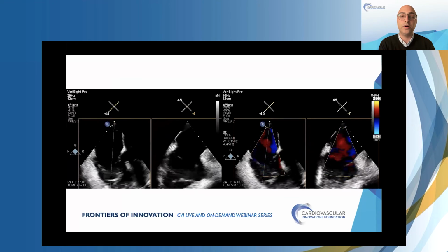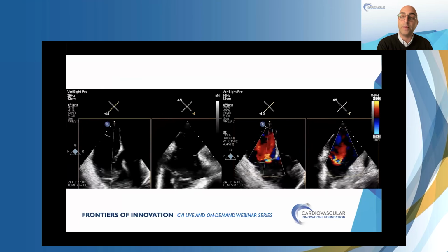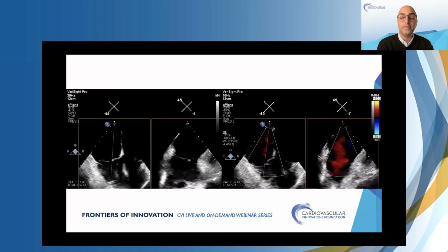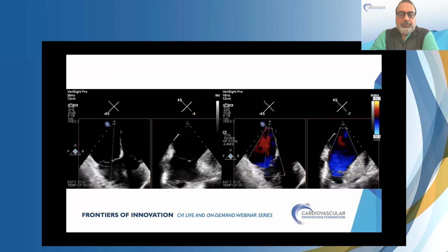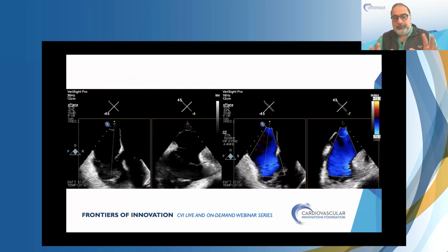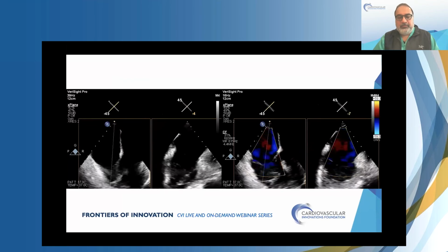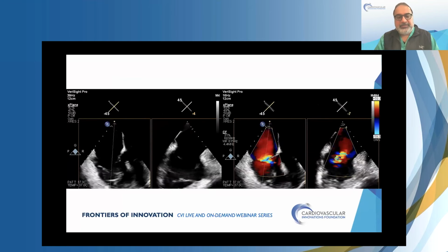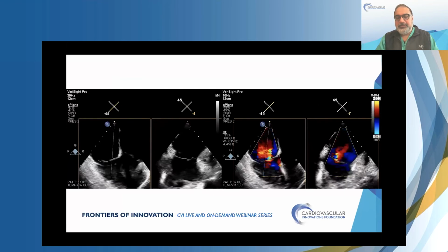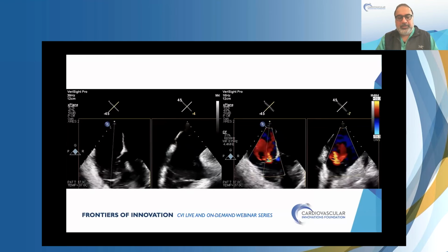Gagan, can you comment maybe on what manipulations you do at this point when you're at -45 to optimize the imaging? Yeah, I think one of the key things that we've learned is that we always maneuver in 0. This is the first time when we're not happy with an image, I'm actually yelling at myself to optimize the image. Usually we're asking our imagers to optimize the image. Really, this time it's on us.